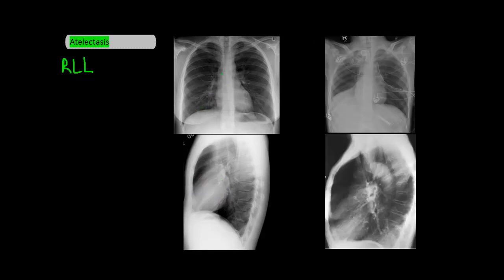For the right lower lobe, on the PA, this is what the normal right lower lobe looks like. With right lower lobe atelectasis, it collapses downwards, and you start to see silhouetting of the right diaphragm. Note that the right heart border is still visible — the right middle lobe is the one in contact with the right heart border, not the right lower lobe. On the lateral, the normal right lower lobe distribution is here, and with atelectasis, the oblique fissure border shifts down and back.